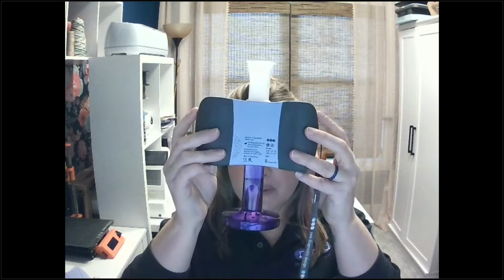All right. I did want to make a special note here. If you are using the EasyOne filter solution, I apologize. Our demonstration software has not been updated to reflect that filter change. So I'm going to show you guys where that is on the actual device here in just a moment, so that it does prompt you prior to every trial to select if you are using a filter or if you are not. All right. Once you are completely set up and ready to go, the patient has been entered into the system, and you've had that last time to double check all of the patient information, whenever you're ready, you can click to start the test.